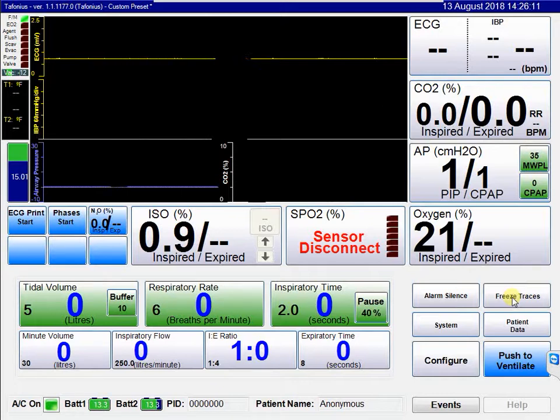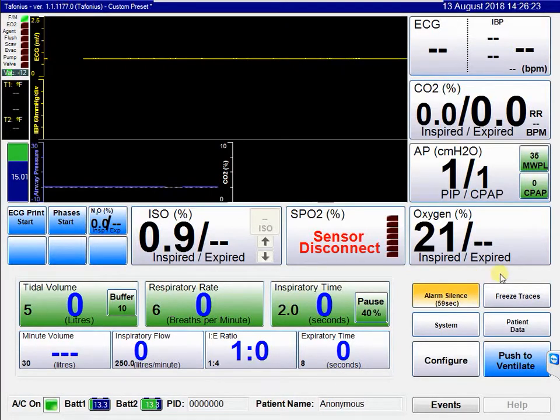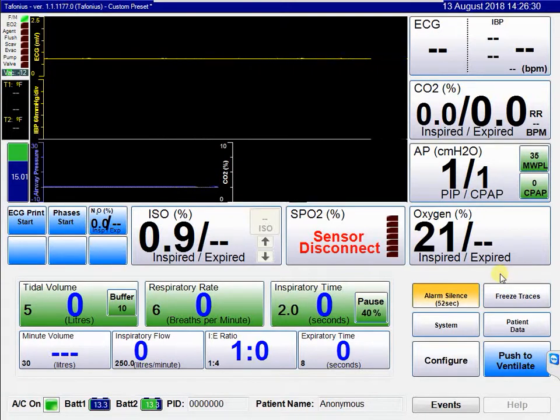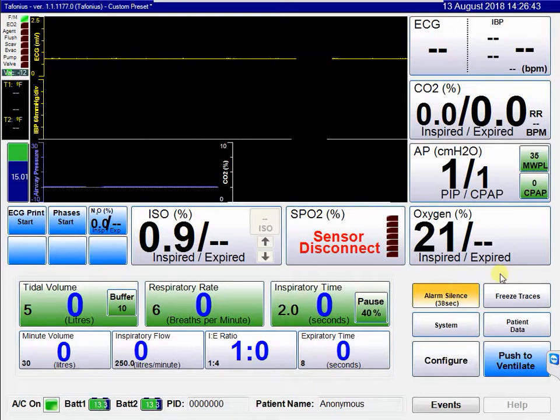We will start with the alarm silence button. Should an alarm be active, it can be silenced in three ways. A single press will silence an alarm for 60 seconds. The alarm silence button changes to an active state, as shown by the change in colour, and the button counts down the seconds until it's inactive again. This is useful when an alarm is periodic and you just want to silence it for 60 seconds.